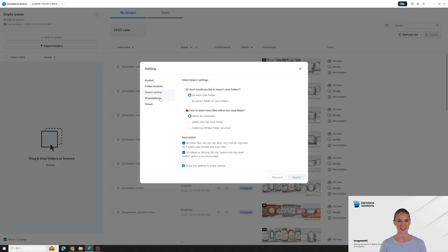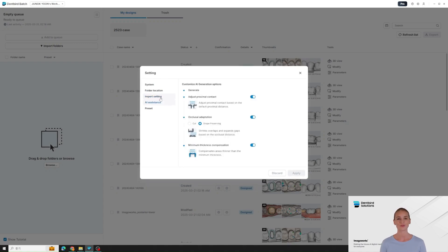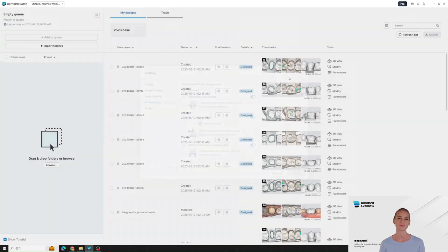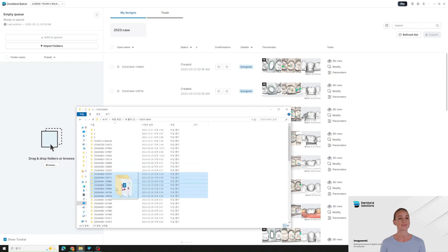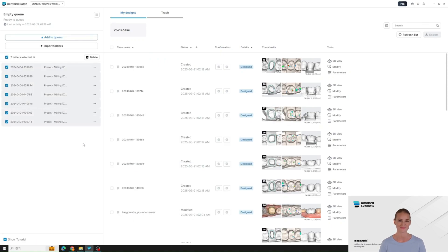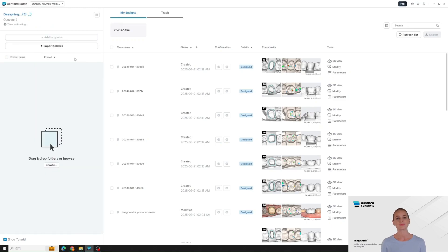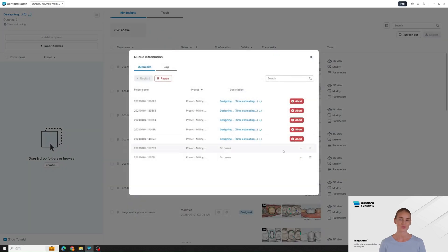DentBird Batch also lets you customize AI generation options, allowing you to fine-tune the design process to fit your needs. You can apply preset design parameters at the account level, ensuring consistency across all cases while saving time on repetitive adjustments. Selecting Shape Preserving allows you to adjust the occlusal distance while maintaining the original AI-generated design. Now upload your files — AI will automatically generate high-quality designs, freeing you from repetitive tasks. You can let AI handle production while you focus on more critical work.